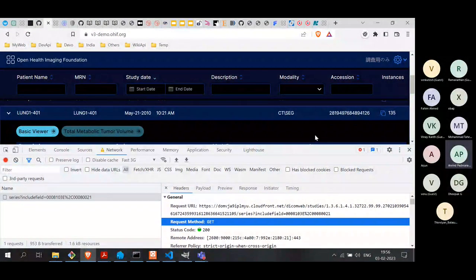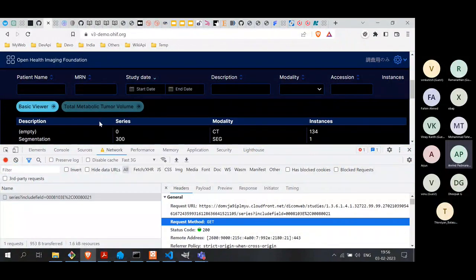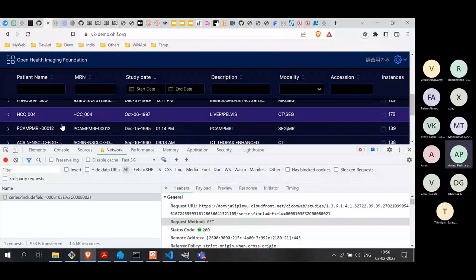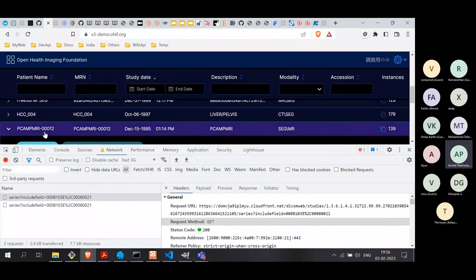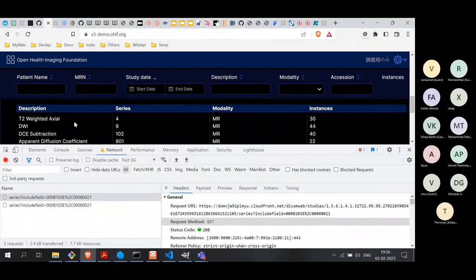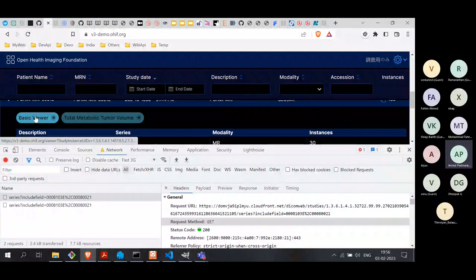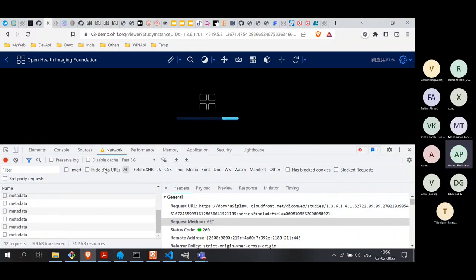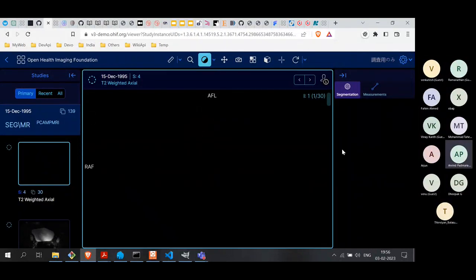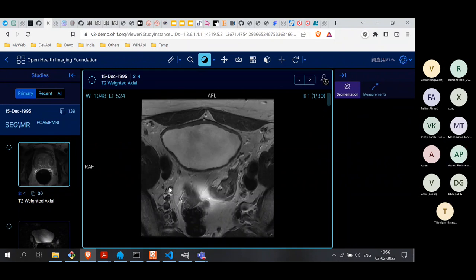This is how the React app actually gets data from the DICOMweb server — it's just REST API calls. The data is not retrieved in advance; it is retrieved only when needed. For example, suppose I go and open something else, then for that particular series a new request will go out. Data is requested only on a need basis. And likewise, when we go into a particular viewer to view a study, the relevant images get downloaded — you can see many requests go out, basically getting those images you are going to be viewing.